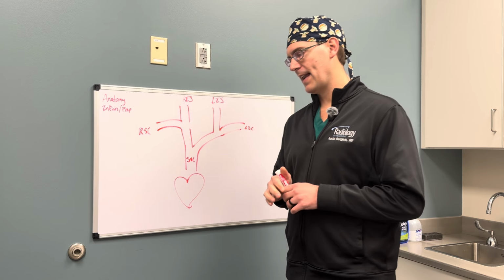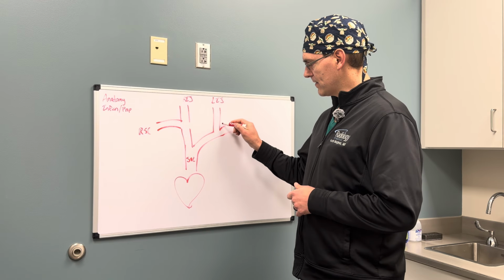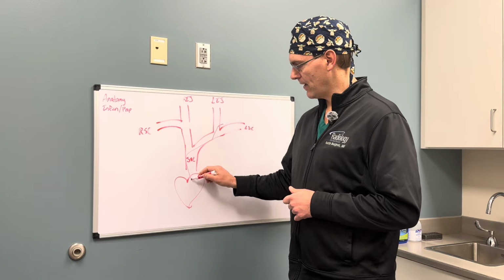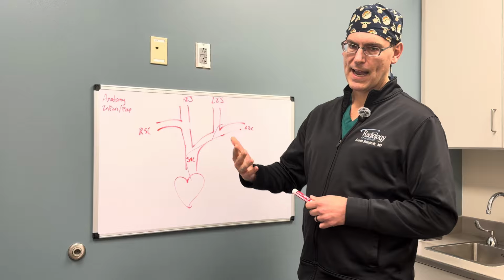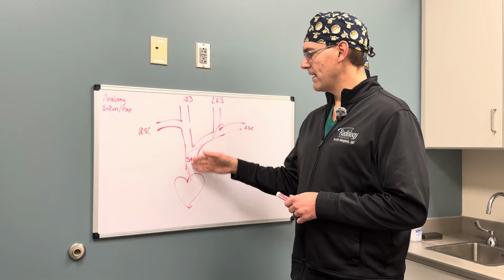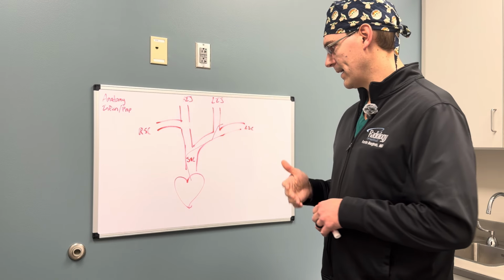So, for example, if we look at the anatomy here, let's go through our different sites of central vein access. Let's say we go with a left IJ access. So this catheter, this tube that we're putting in, goes in here, and it comes down and makes contact with the vein here, and hopefully the tip ends up in an area that's more free floating where there's cardiac motion. And so at the entry point, at the subclavian or brachiocephalic contact point, and in the SVC, there is an area of prolonged contact with the vein where scar tissue or narrowing can form.